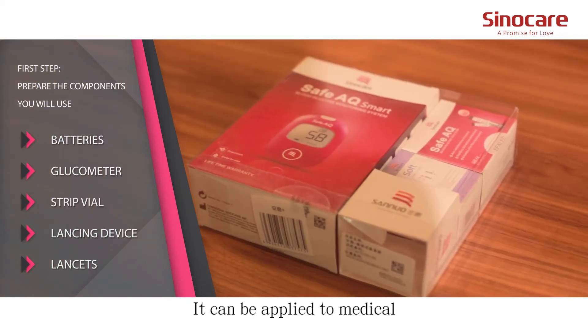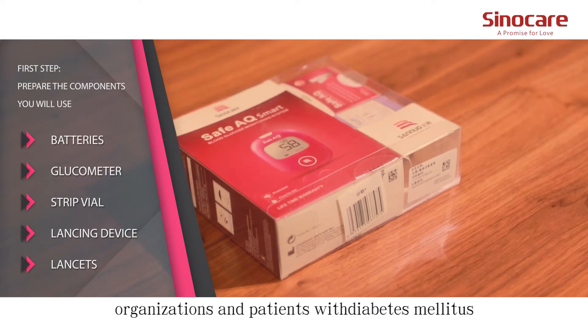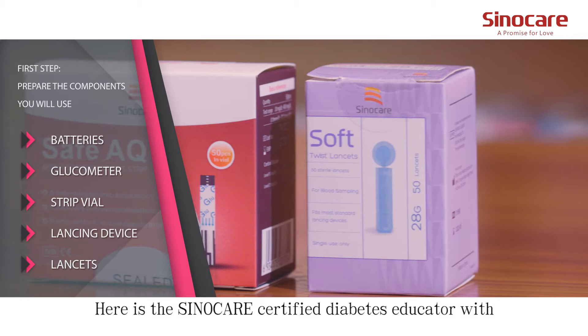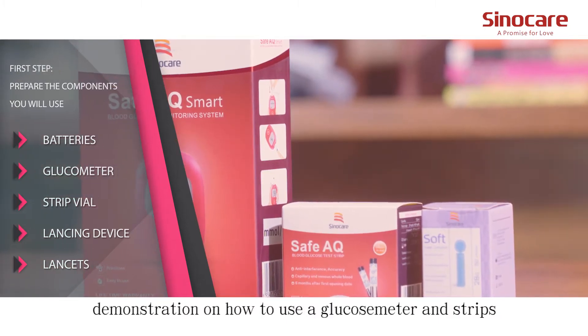It can be applied to medical organizations and patients with diabetes mellitus. Here is the SinoCare Certified Diabetes Educator with a demonstration on how to use a glucose meter and strips.